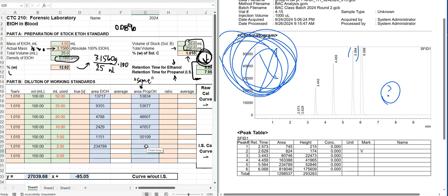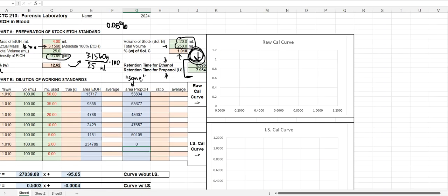All right, so let's talk about the problem with the internal standard. If you do not have internal standards in your standard set, you cannot include the standard. And that's because we're getting ready to do a little bit of math here. The whole purpose of this column was to make sure the injection was performing the same way.